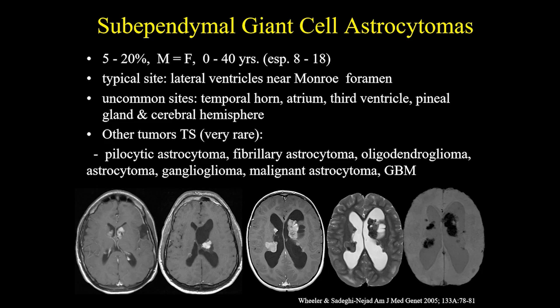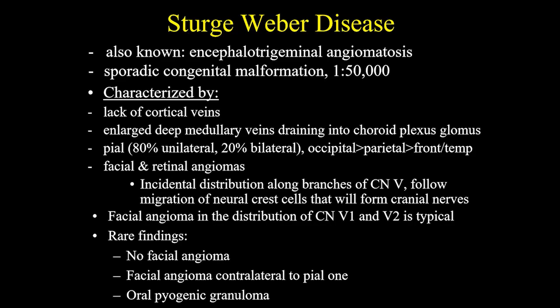5 to 20% of patients can have subependymal giant cell astrocytoma. Typically, it is located in the lateral ventricles near the foramen of Monro. Uncommon sites have been described in the temporal horn of the ventricles, atrium, third ventricle, and pineal gland, as well as in the cerebral hemisphere. Other tumors in tuberous sclerosis are very rare but have been described. Here we have two patients with examples of subependymal giant cell astrocytoma located in the foramen of Monro and also in the lateral subependymal ventricular region, showing some calcification and contrast enhancement.